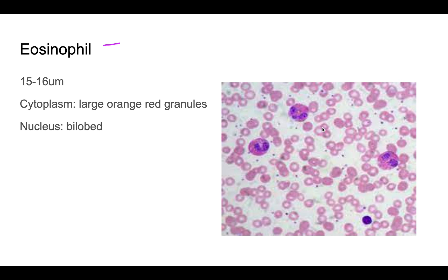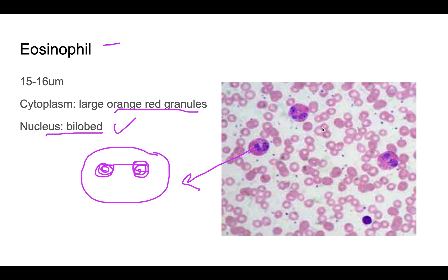The most characteristic feature of the eosinophil is its cytoplasm and granules. The granules are orange-red or brick-red in color and are slightly coarser than those of neutrophils. The nucleus characteristically has two lobes — bilobed, like a spectacle — though three-lobed eosinophils can also occur.